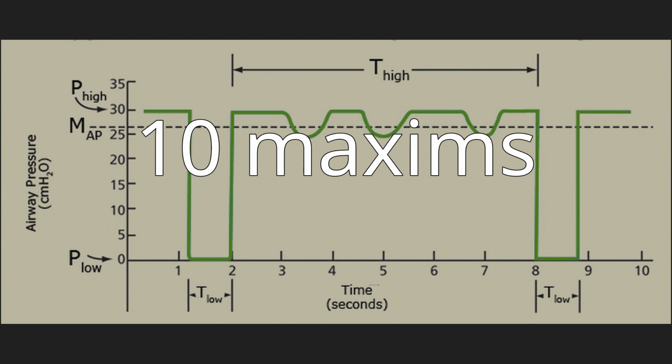Breaths are classified as spontaneous or mandatory based on both the trigger and cycle events. A spontaneous breath is a breath for which the patient both triggers and cycles the breath. Spontaneous breath may occur during a mandatory breath, e.g. airway pressure release ventilation. Spontaneous breath may be assisted or unassisted. Mandatory breath is a breath for which the machine triggers and or cycles the breath. Mandatory breath can occur during a spontaneous breath, e.g. high-frequency jet ventilation. Mandatory breath is, by definition, assisted.